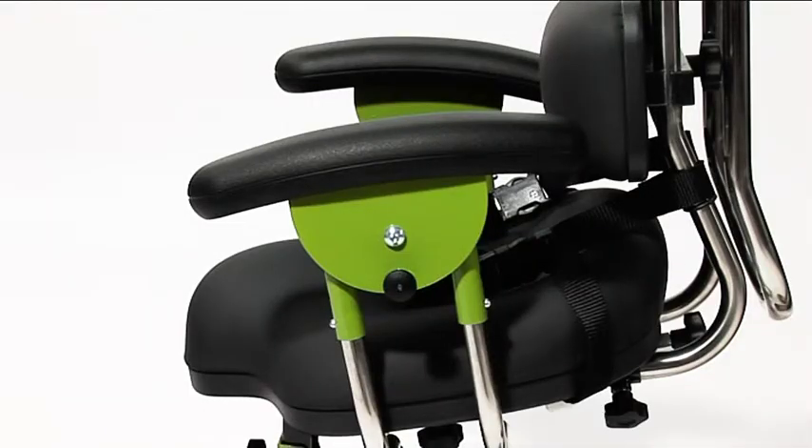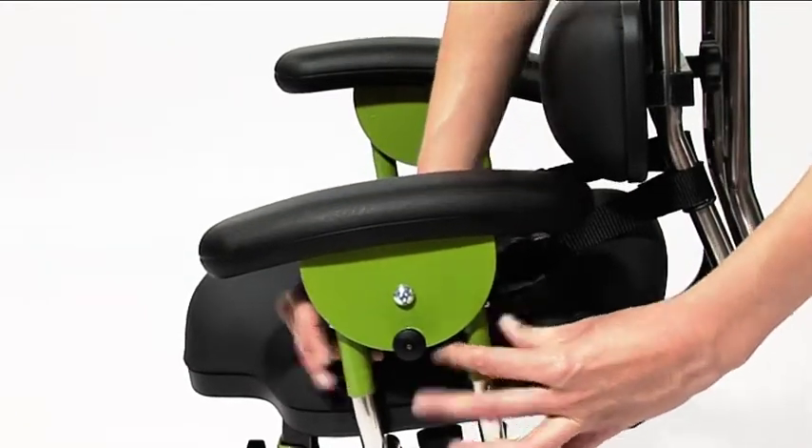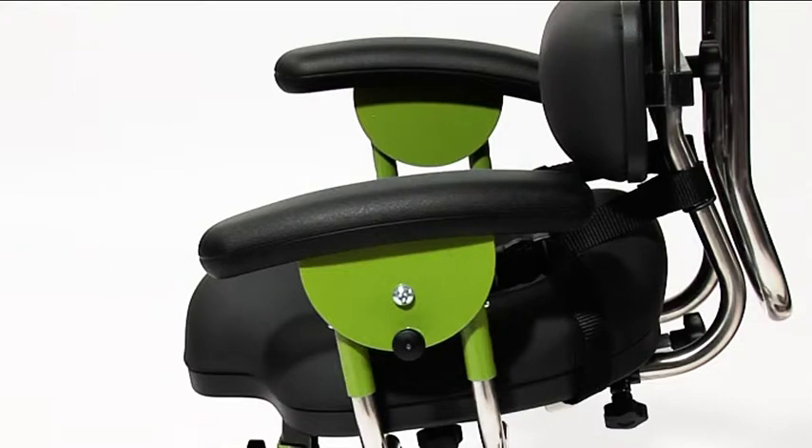To adjust the height of the armrests, depress the spring pins. Slide the armrests to the desired position, then ensure both spring pins are re-engaged.